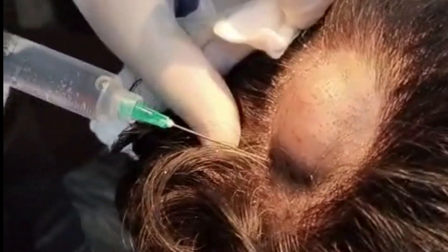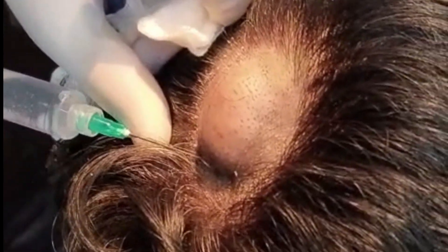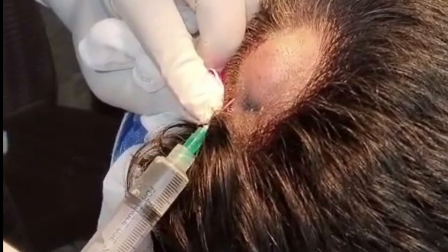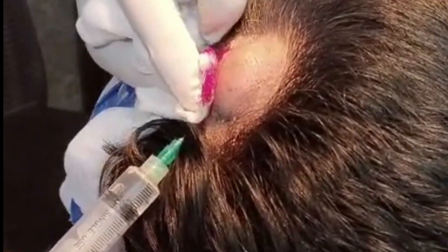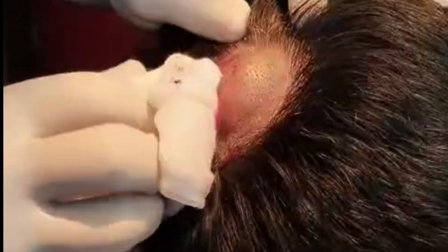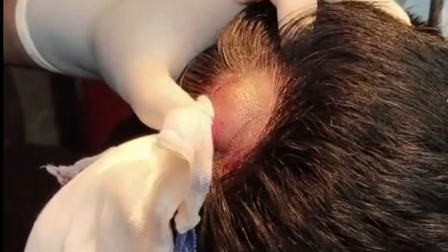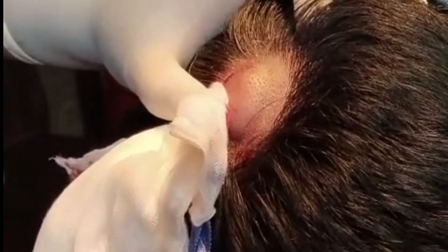We have administered a local anesthetic lignocaine injection into the scalp to numb the surgical area before proceeding with the excision of the pilar cyst. This is the surgical removal of a pilar cyst from the scalp.